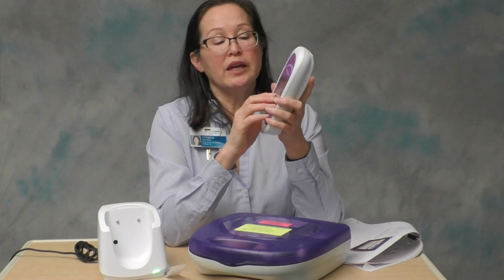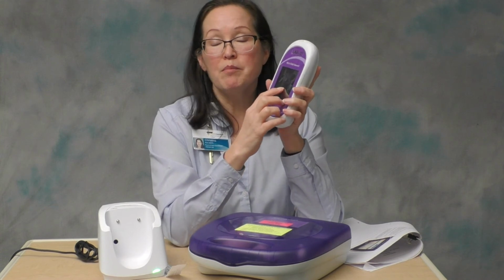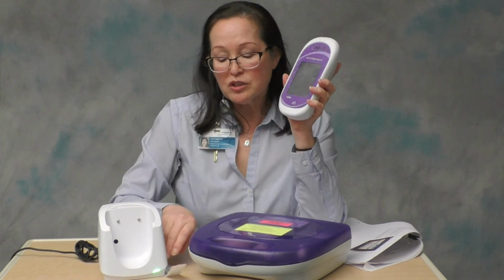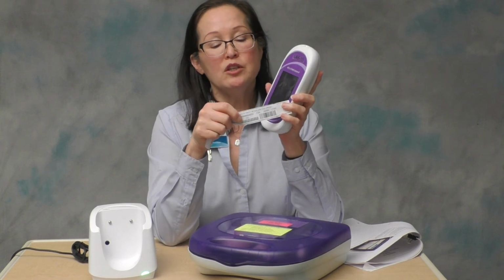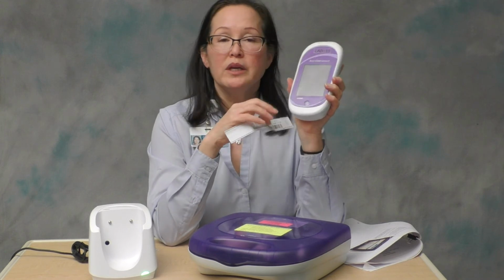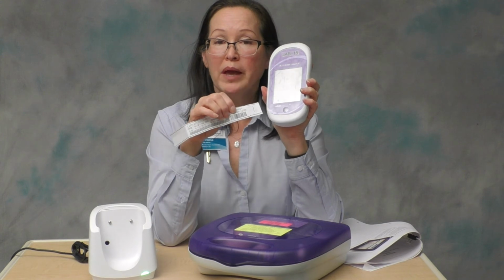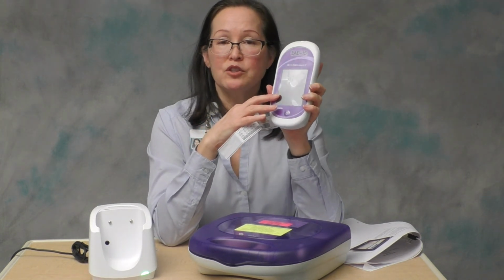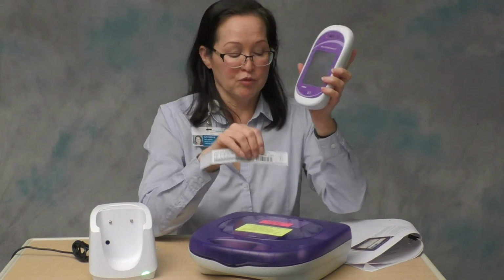It doesn't indicate that you've got the wrong ID. It just means you need to verify that the CSN number displayed on that message matches the CSN number on the patient's armband. If they match, then you can hit the green check mark and proceed with testing. So either name and date of birth match or a CSN number match, but please use this pop-up screen, this safety feature, to ensure that you're performing the correct test on the correct patient before you hit the green check mark.